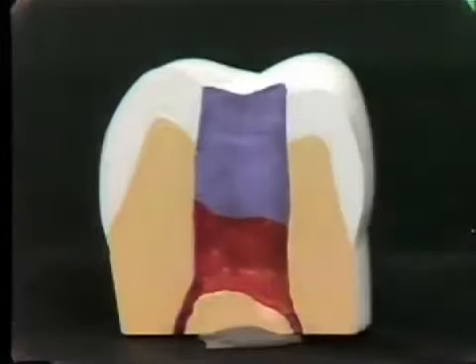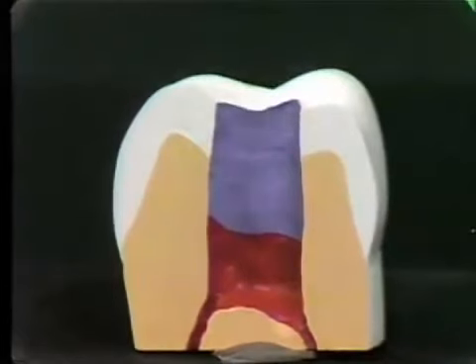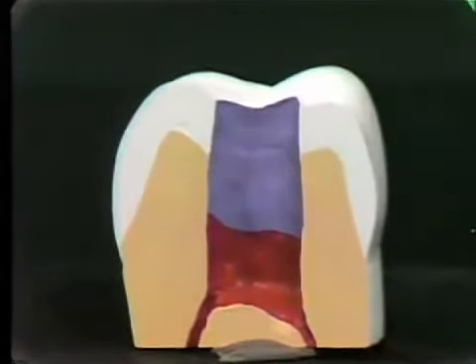We have the final preparation, completely unroofed. The floor is left untouched. The walls are left untouched. The roof is off, and the pulp chamber is clean.